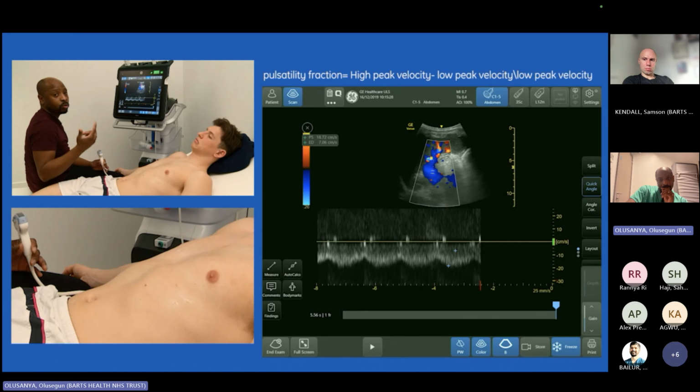Now, when examining the kidneys for venous congestion, what you're looking to do is to get a Doppler signal that combines both the renal artery and renal vein. You can get both signals at once, one above the baseline, which will be the renal artery, and one below the baseline, which will be the renal vein. You're looking for a segmental structure, so you want a vessel that's just in the outer cortex. If you divide the cortex into thirds, anything from the inner third of the cortex outwards.